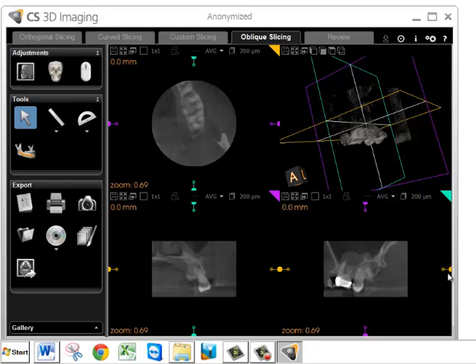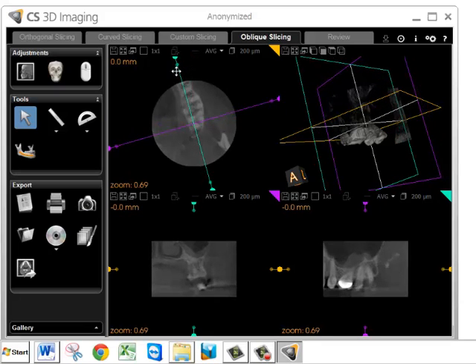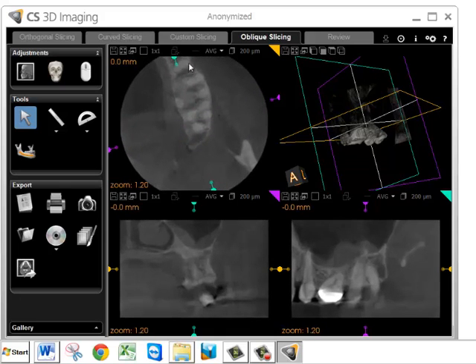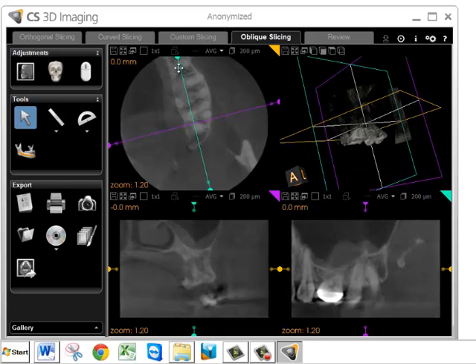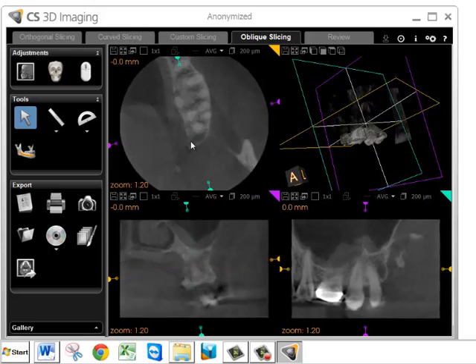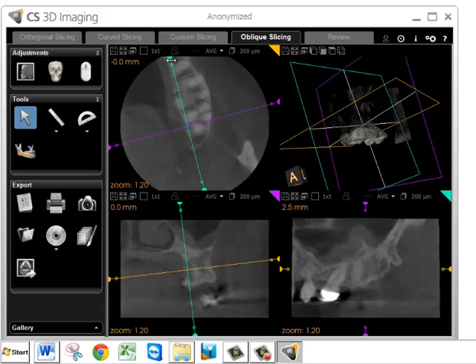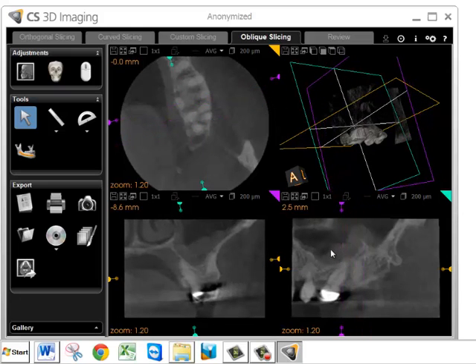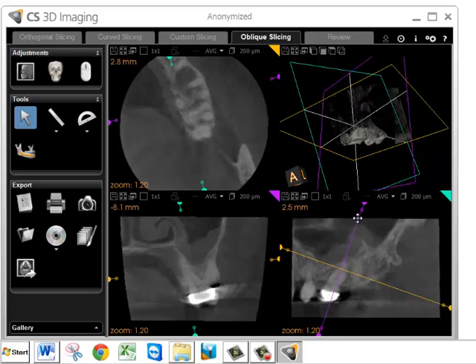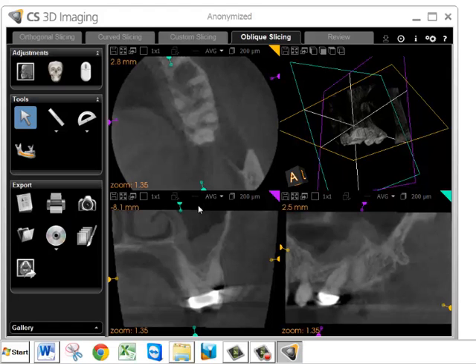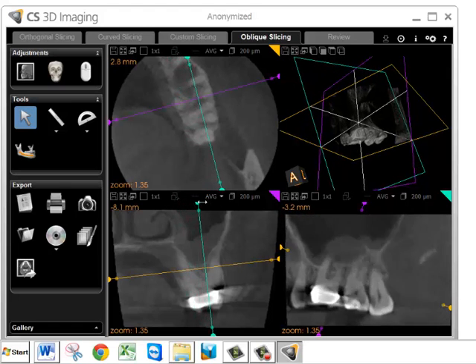We have the same color code, but in the oblique slice, when you mouse over the small circle, the cursor becomes a four-way arrow. When you hold down the left mouse button, you can rotate that slice through the volume, changing the angle in all of the windows. For example, if you were concerned about the palatal root of a second molar or first molar, you simply align all the slices to that root so you can see it in all three windows, then move the slice back and forth to see the anatomy better.